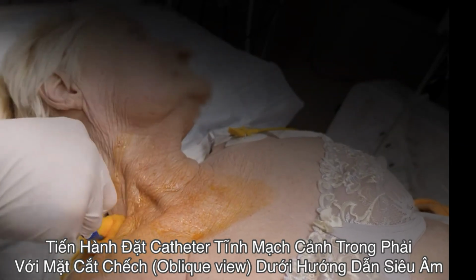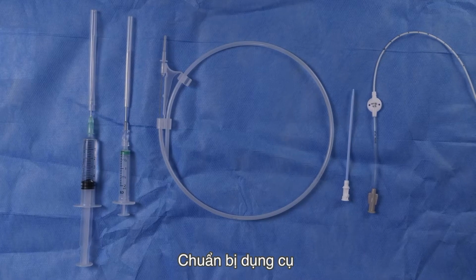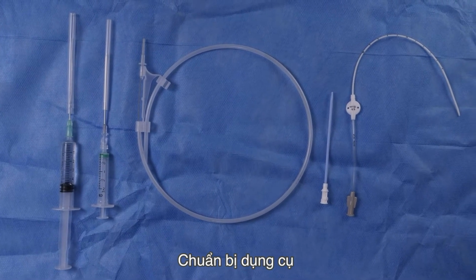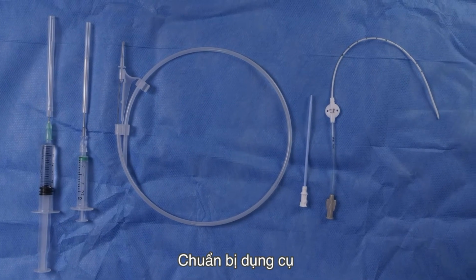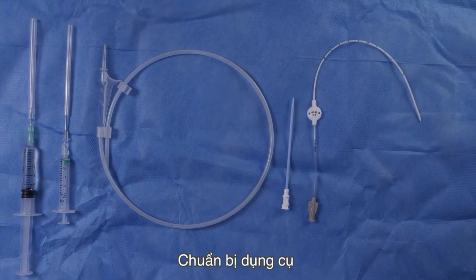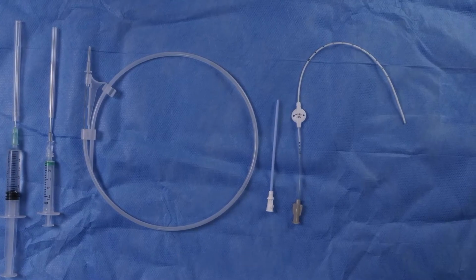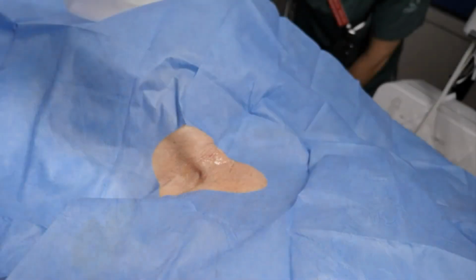Now prep a large area of the neck. While waiting for the chlorhexidine to dry, prep your tray. Place your equipment in the order you will be using it, and make sure to loosen all needle covers. Everything should be easily accessible by one hand, since you do not want to move the probe once you've located the perfect ultrasound view. Drape the patient.